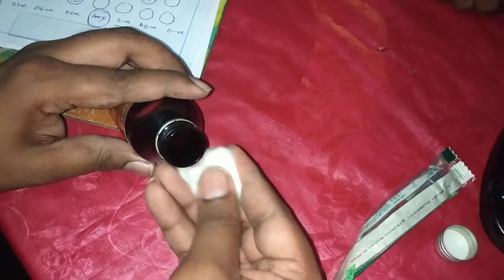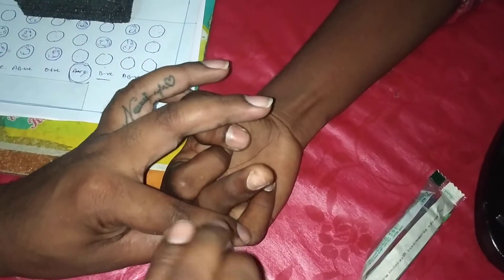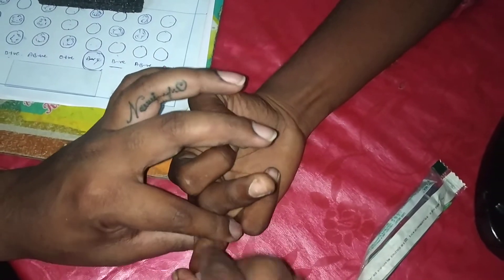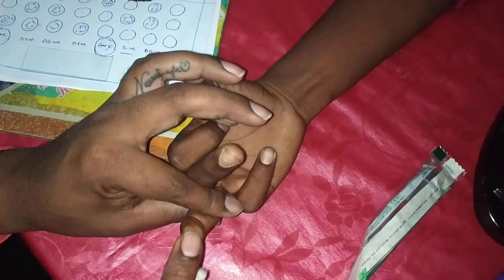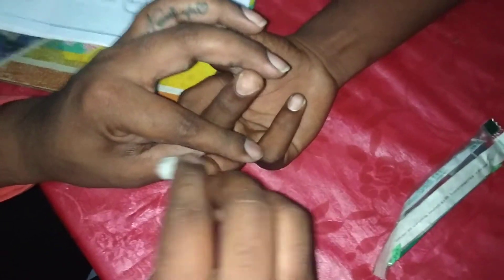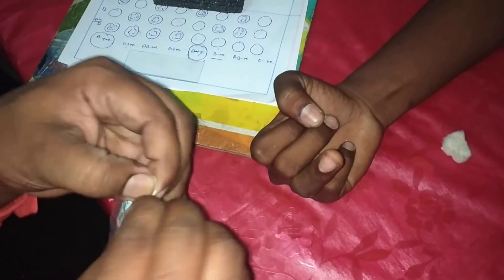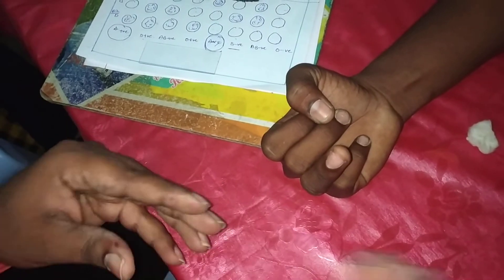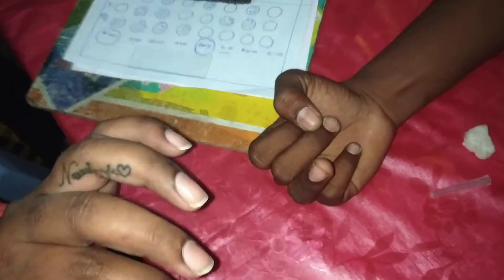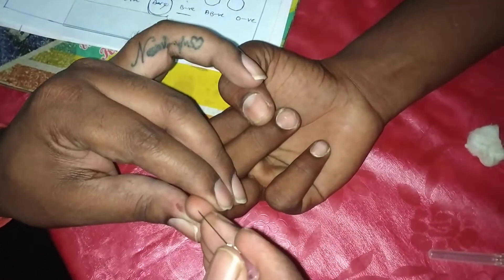First, take spirit cotton and sterilize the ring finger of the patient. Never blow air with your mouth — let it air dry. Now, if you have a lancet, use a lancet; if not, open a fresh syringe and take a fresh needle. Make a puncture.